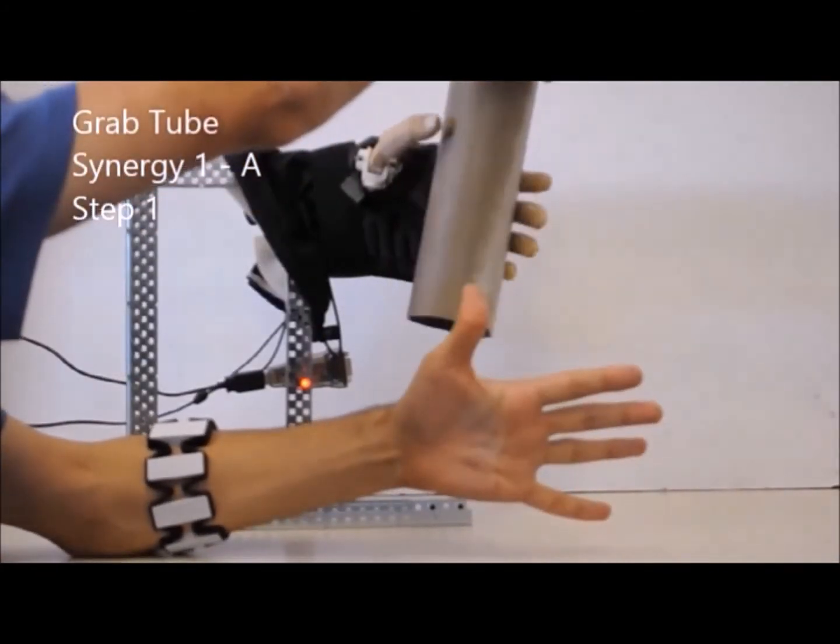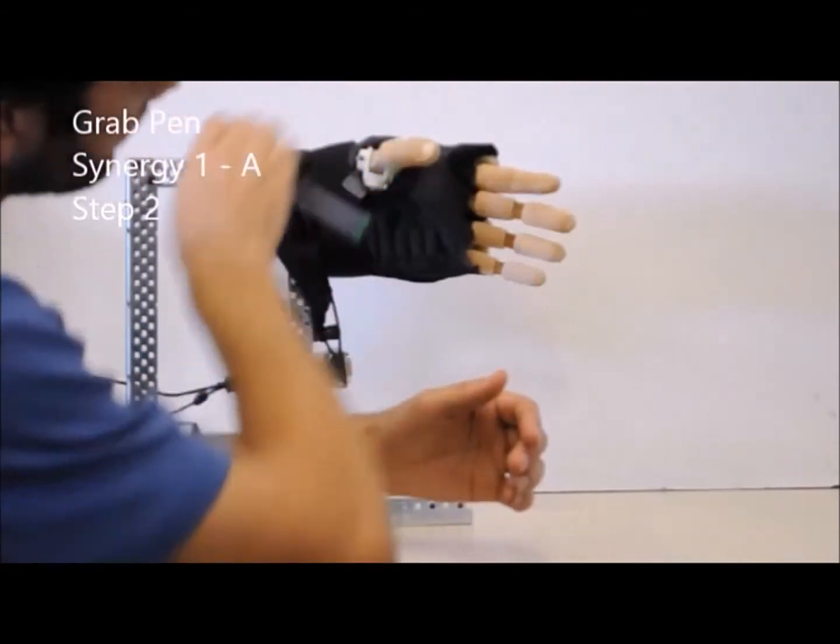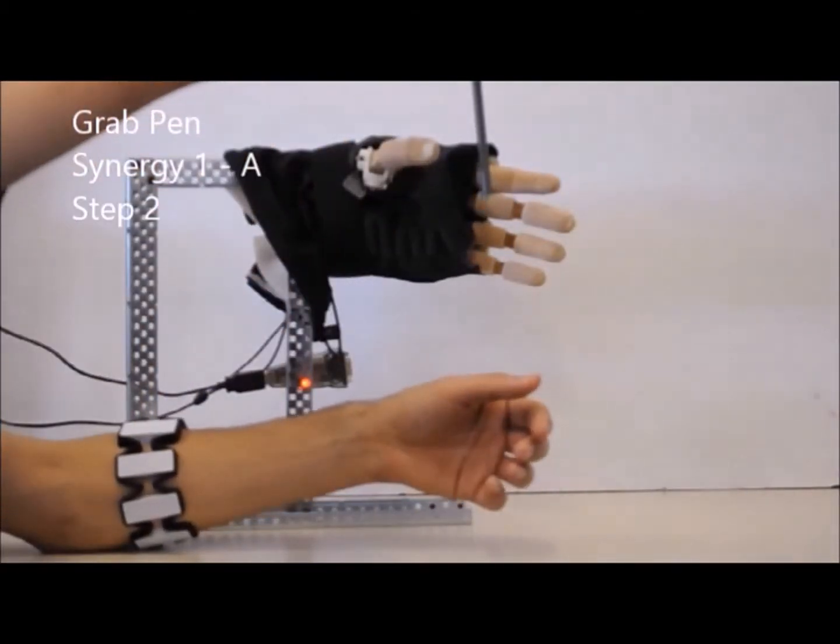In this way, only with the first synergy, the hand is able to achieve 21 out of the 33 grasped forms.